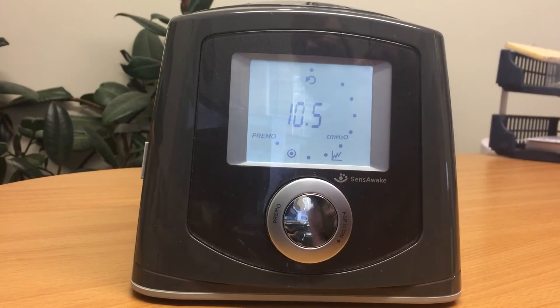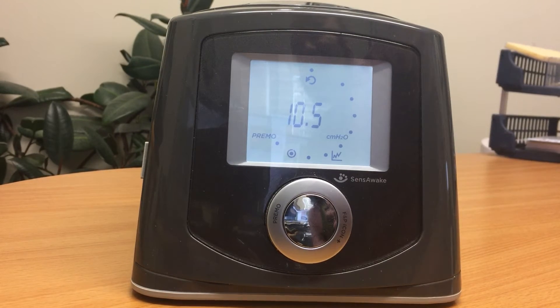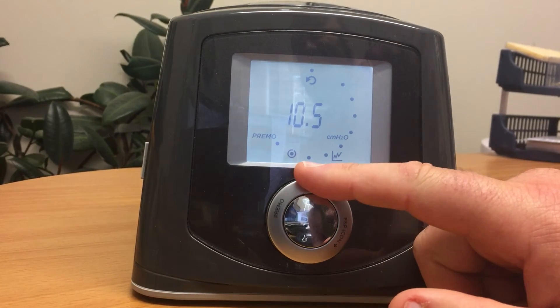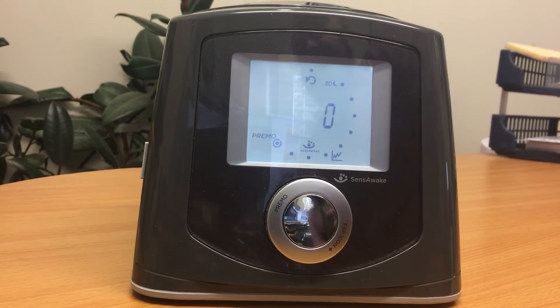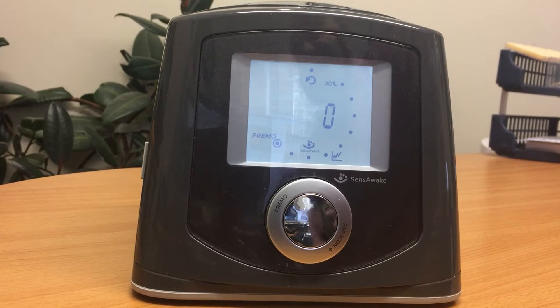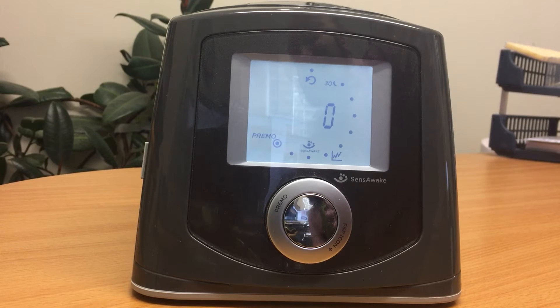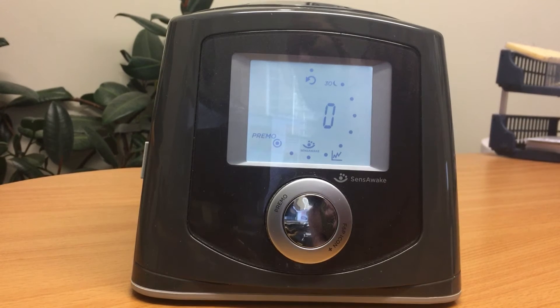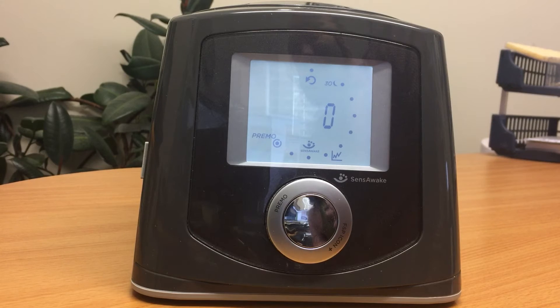The next setting shows the pressure the machine is set for. The last figure is the number of times the machine has detected awakenings, if the sensor wake feature is activated. In this case, sensor wake is not activated, so the number is zero.